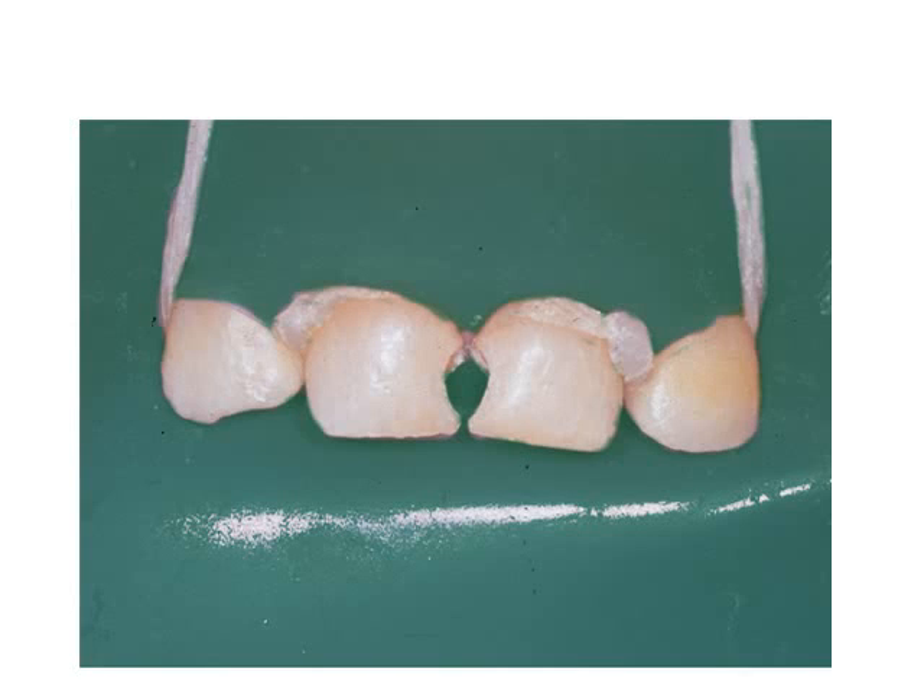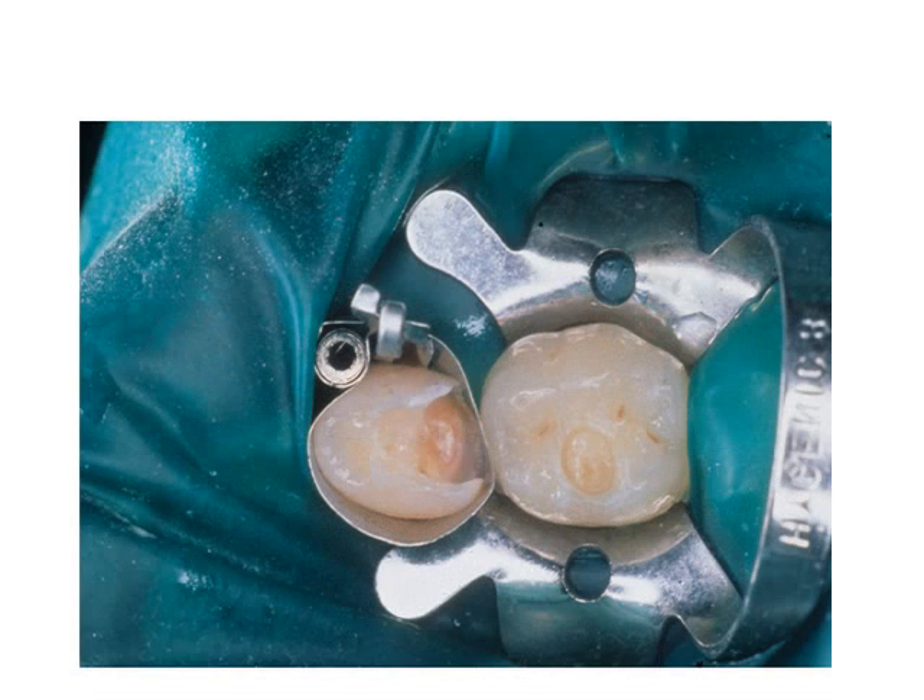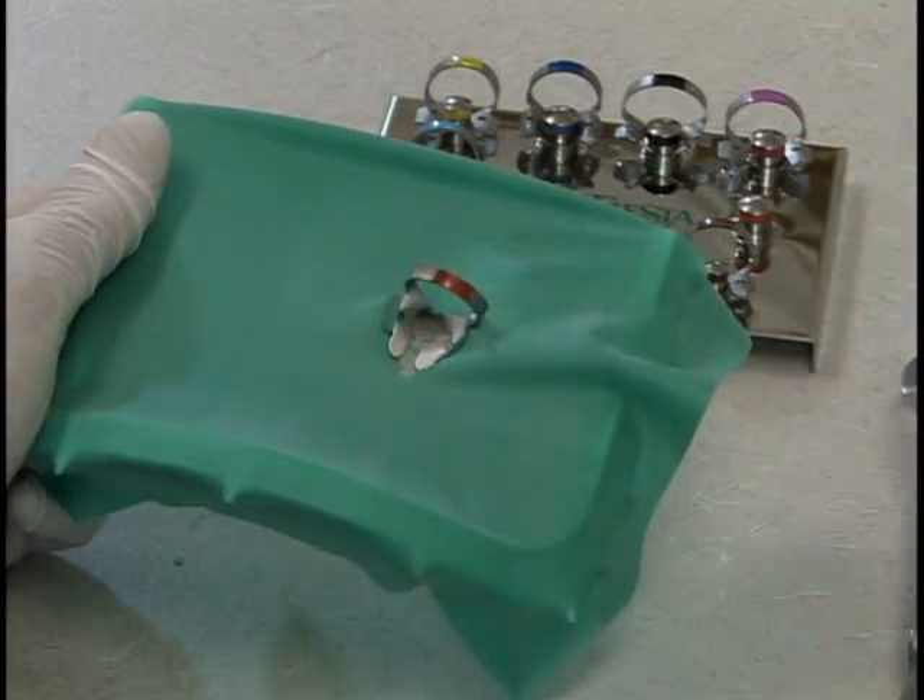For paedodontic isolations, include only the teeth in the immediate area. The dental dam may also be quickly applied for paedodontic isolations using non-traditional techniques such as the general field isolation.